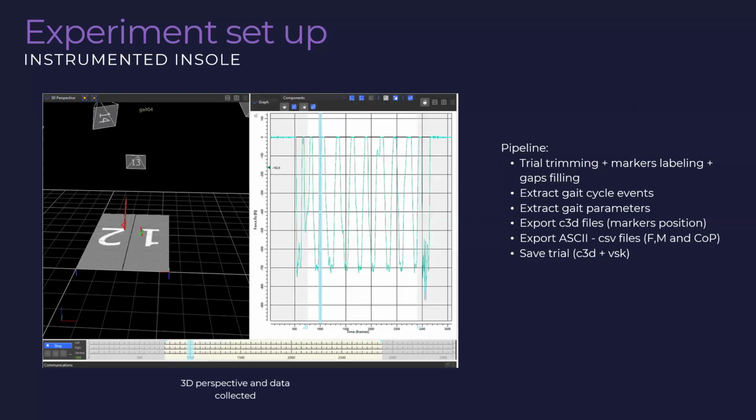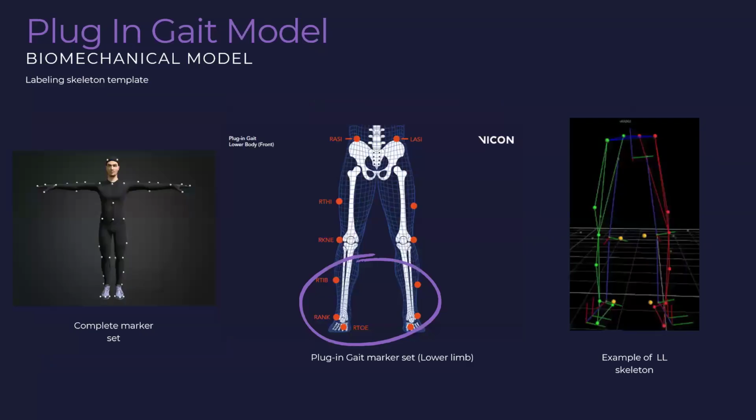Yeah. So for that biomechanical model, this is a standard model. So you have specific placement of the markers, and each marker corresponds to a specific place. So you try to add it to that specific place, like different joints, and it creates the skeleton. It somehow accounts for the differences between the biomechanical parameters of different subjects, right? Mhm. So you do that.